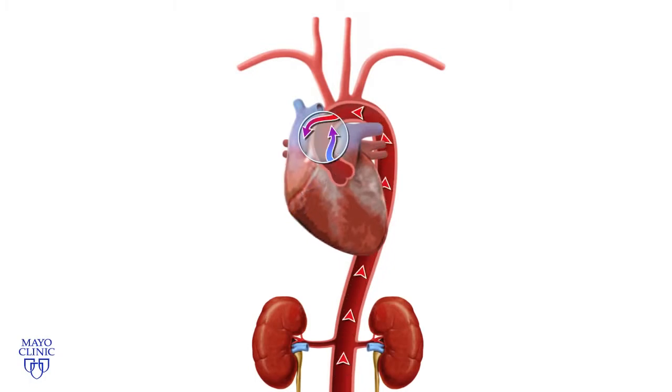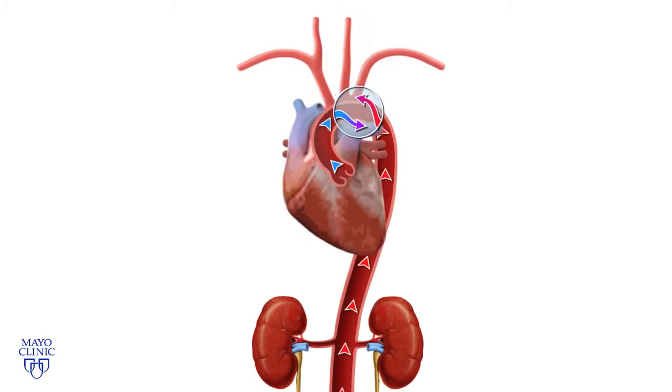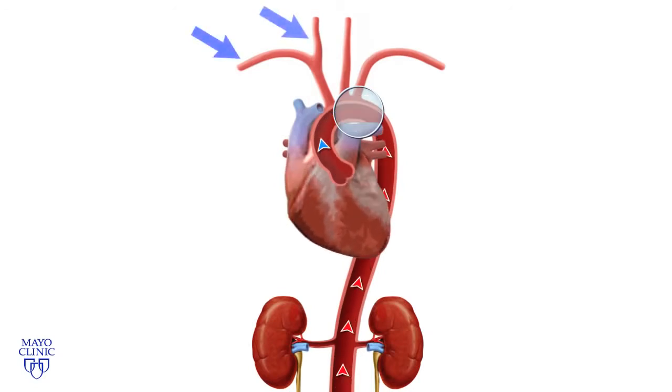As the heart contracts more and more forcefully, or as ECMO flows decrease, the location of the mixing cloud can migrate more distally in the aorta. In the scenario illustrated here, consider the impact of the circulatory pattern on cerebral perfusion. The brachiocephalic artery is perfused by blood from the left ventricle, which may be poorly oxygenated.